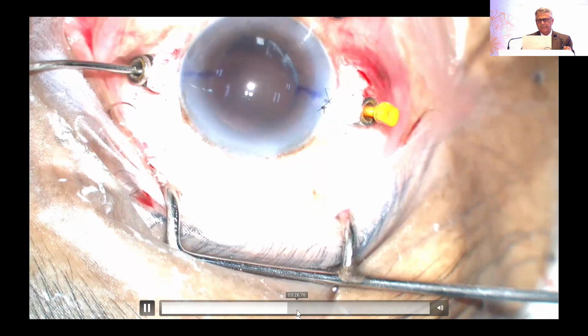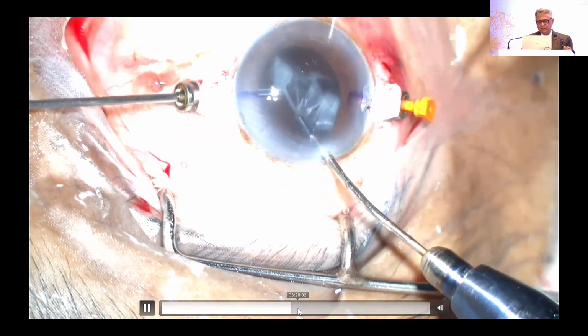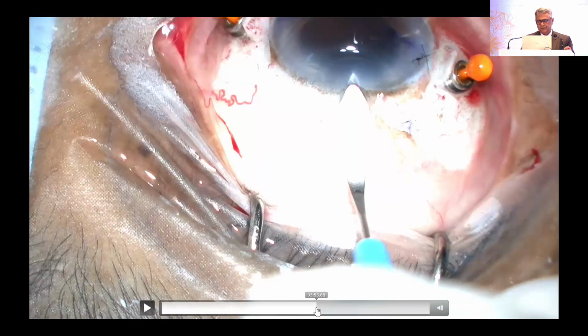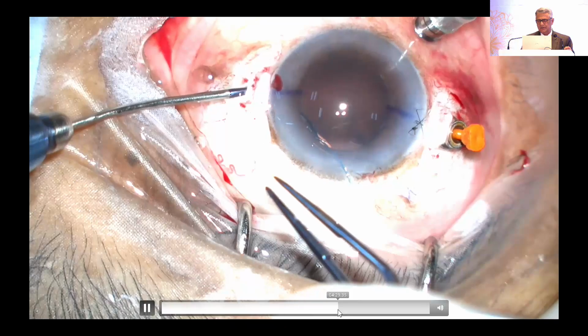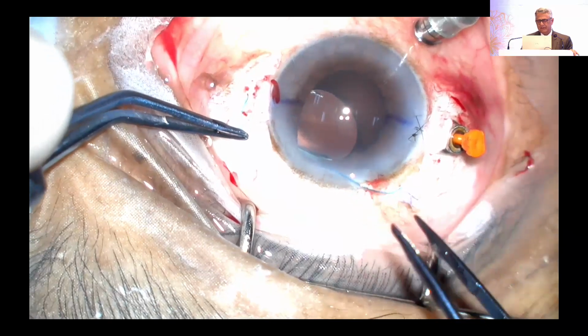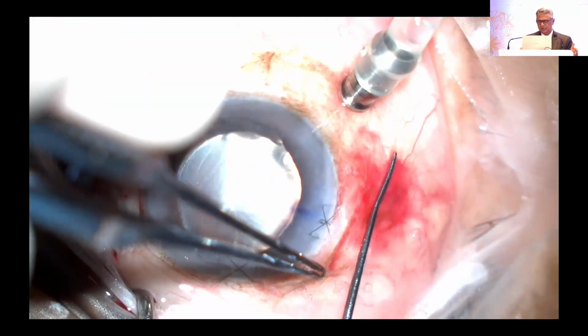So that is the end of vitrectomy, and then for the glued IOL, this cortical matter first has to be removed from behind the capsule. Ensure with wide angle that there are no peripheral issues, no posterior segment complications, no iatrogenic breaks or pre-existing breaks also. Also a base vitrectomy is done. And then enlarge this incision and put in an IOL, catch hold of it. You see this, I think Priya and Amar have taught us very well this glued IOL technique. And ultimately this IOL is very well centered, and we put in the glue and suture it.